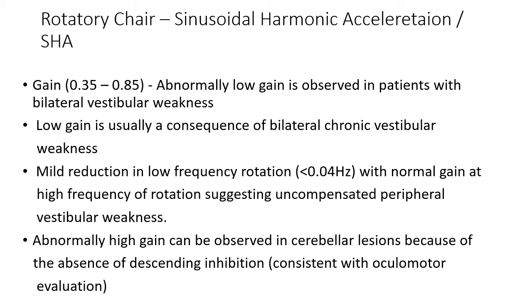If we get a result with low gain for all the frequencies tested, it suggests bilateral vestibular weakness. It is usually a consequence of bilateral chronic vestibular weakness.